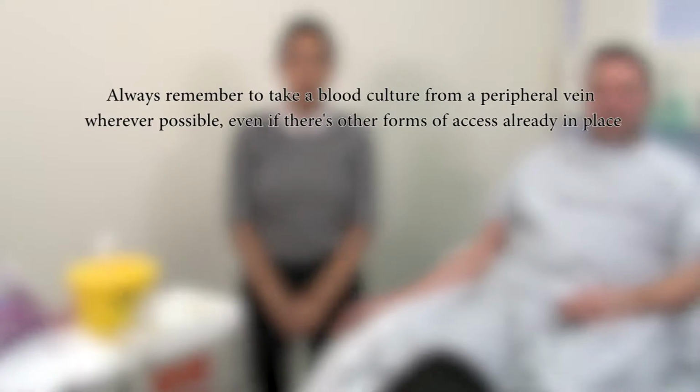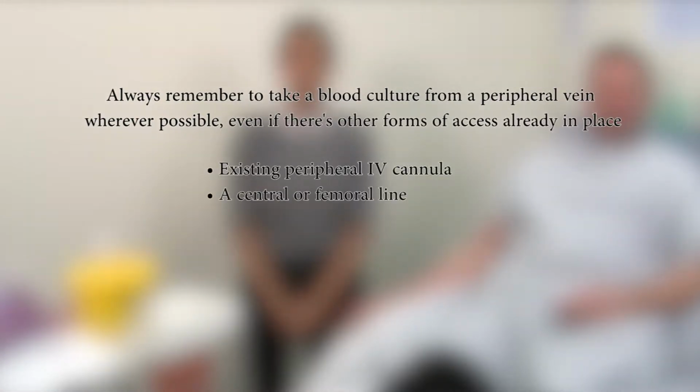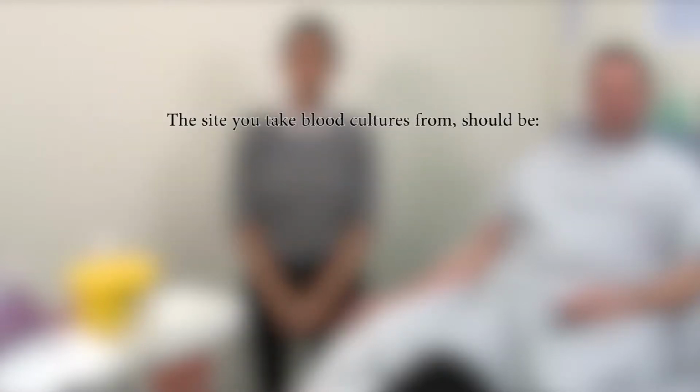It's important to always remember to take blood cultures from a peripheral vein wherever possible, even if there's other forms of access already in place, such as an existing peripheral cannula or a central or femoral line. It's important that the site that we take the blood cultures from is kept clean, healthy and is not broken, and that an aseptic non-touch technique is used.